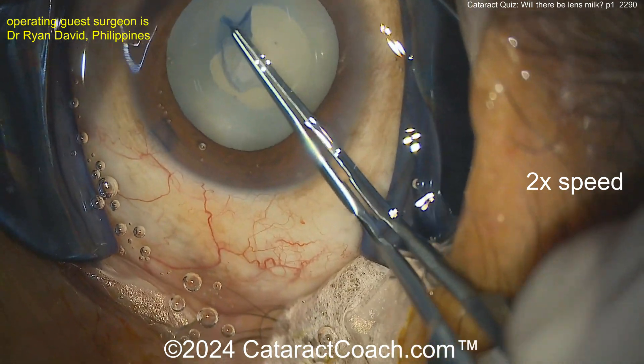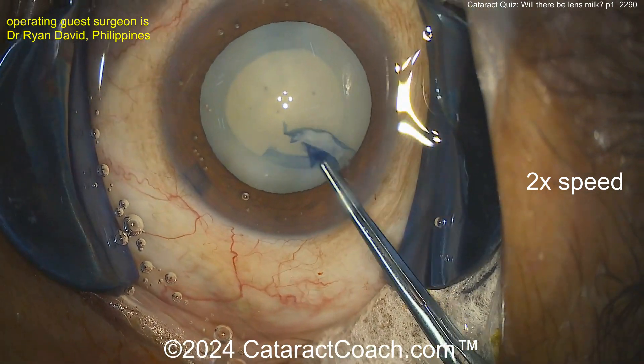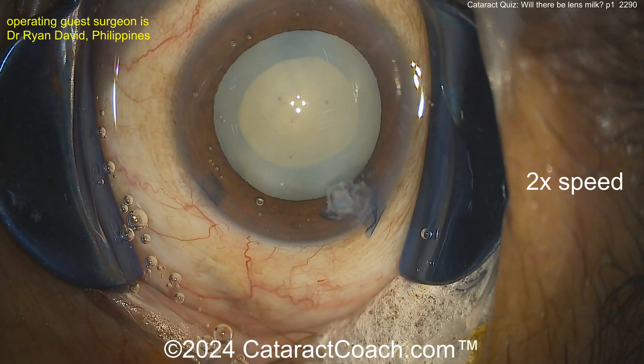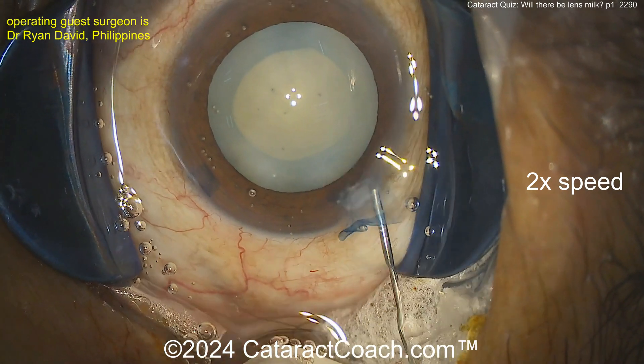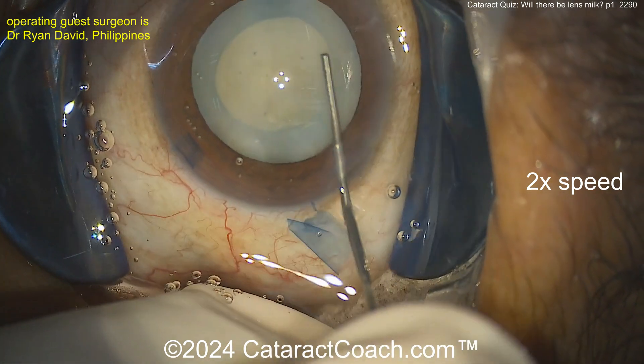It's sometimes a bit of a challenge, but to me that uniform color - where it's kind of a little more yellowy than that pure whitish - is a clue. Sometimes with a white cataract you'll see little clefts of water in there, and that can be a hint. But in this one, look at that - no lens milk at all.